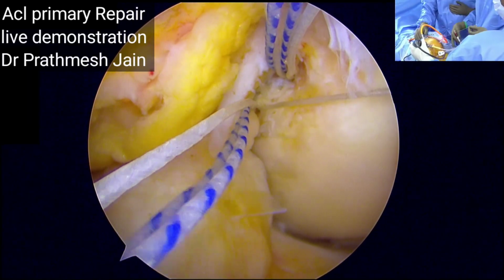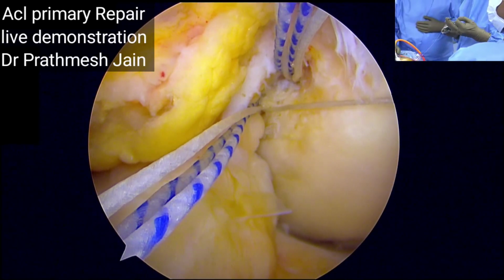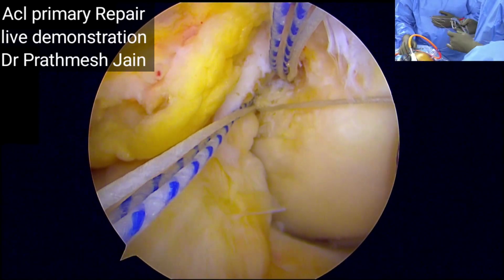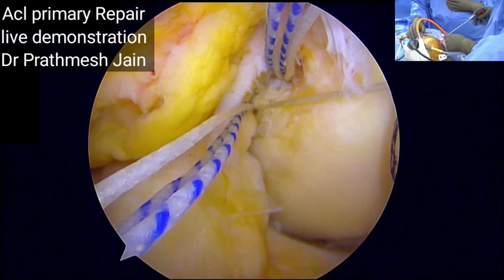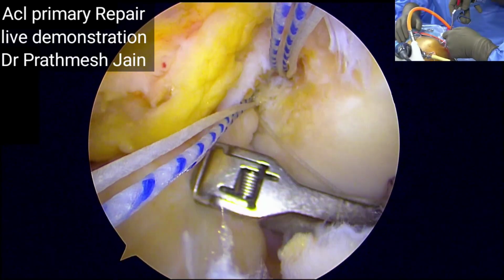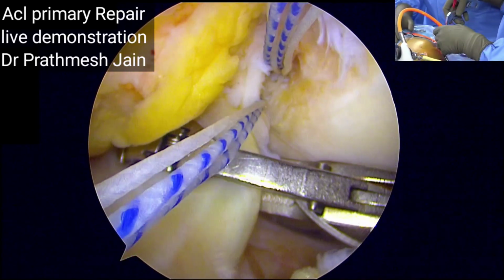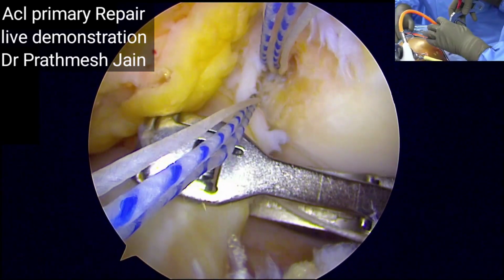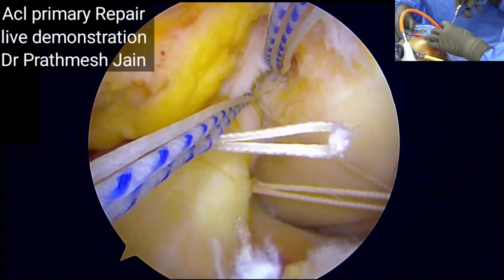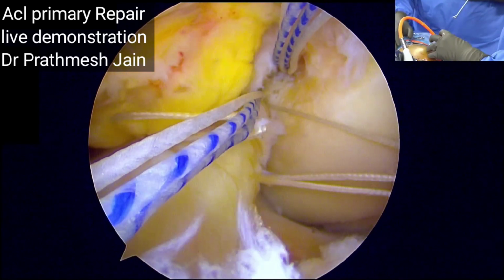The knee scorpion is pretty handy to use with this kind of repair because it is a low profile instrument and it will take only 2-0 or number 0 sutures into its flange. So that is why the knee scorpion is a very, very good device to do these kinds of repair. Green retriever please.